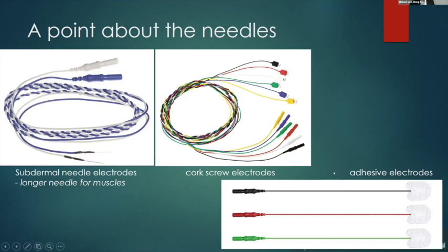And if you want something less invasive, you can have adhesive electrodes. However, when it gets wet, it will loosen. So it's also not as specific as a needle or corkscrew electrode.